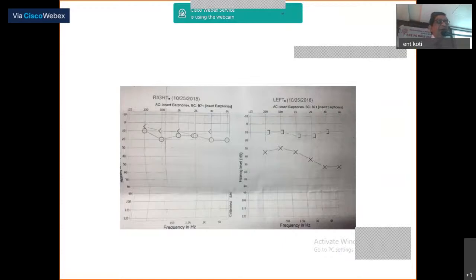So this delivers a sound which is also called a pure tone. That means a sound of that particular tone, and there is no other tone in that. If all of them are mixed together, it is called white noise. If all the colors come together, it is white, and when you separate the colors, it becomes different colors. In the same way, the sounds are shifted from white noise to different frequencies, and each frequency is tested at one time. We have 125, 250, 500, 1000 Hz, 2000 Hz, 3000, 4000, and 6000.